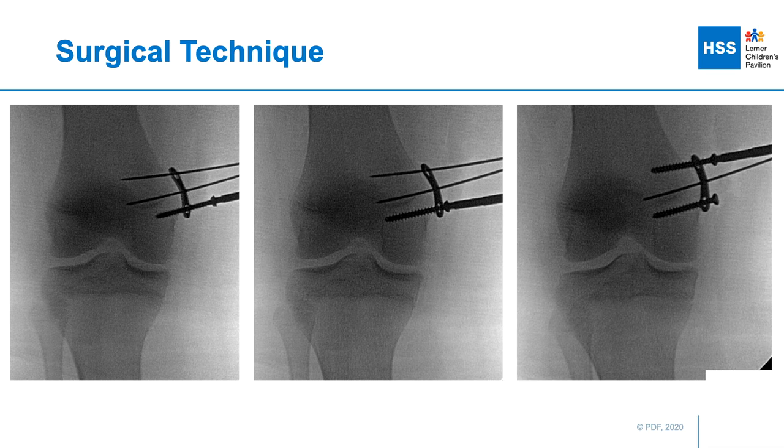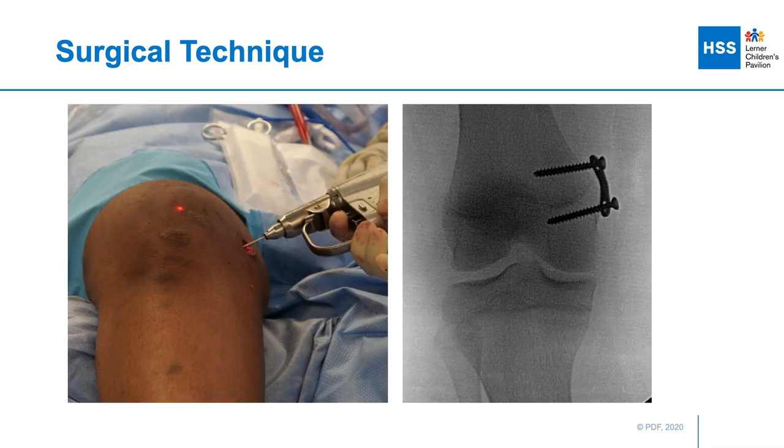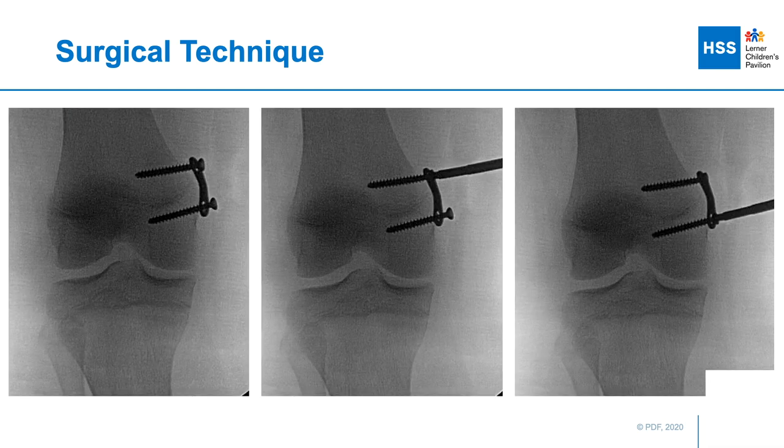I follow the same steps for the proximal metaphyseal screw — drilling in a cannulated fashion, removing the wire, and placing that screw down to the level of the plate. Prior to final tightening, I remove the central guide wire so that the plate can rest anatomically on the cortex of the medial distal femur.